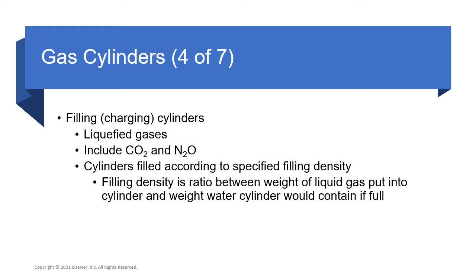Liquefied gases. Gases with critical temperatures greater than room temperature can be stored as liquids at room temperature. These gases include carbon dioxide and nitrous oxide. Rather than being filled to a filling pressure, cylinders of these gases are filled according to a specific filling density. The filling density is the ratio between the weight of the liquid gas put into the cylinder and the weight of water the cylinder could contain if it were full.